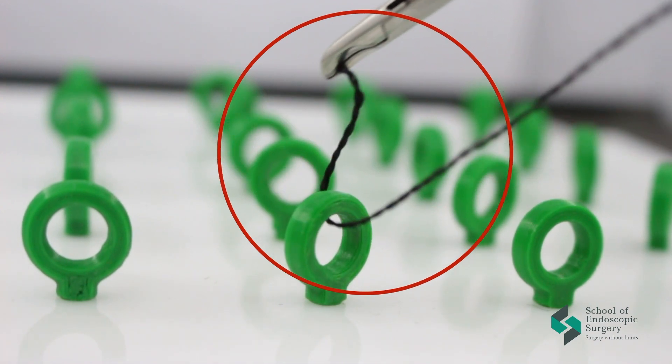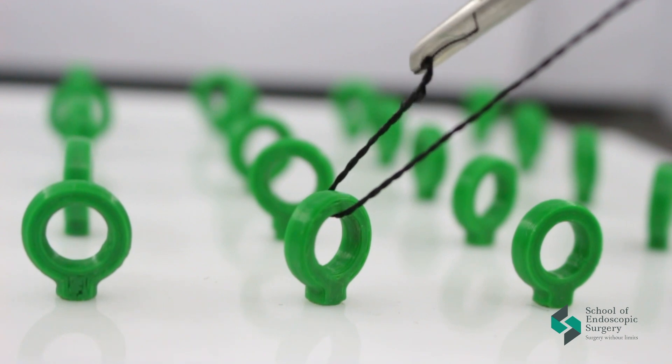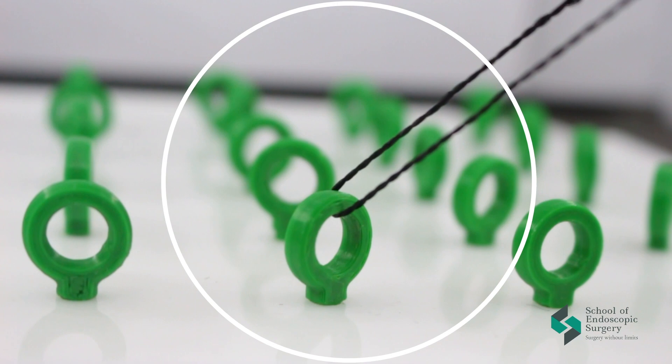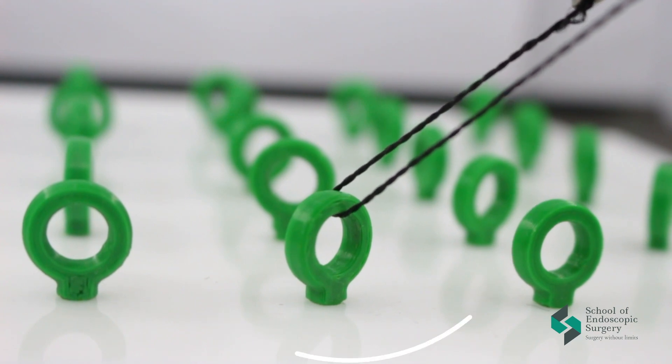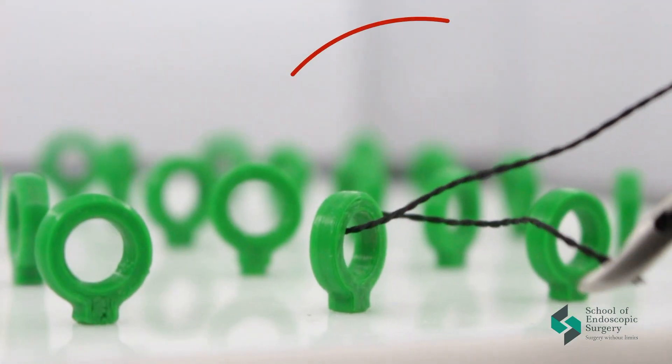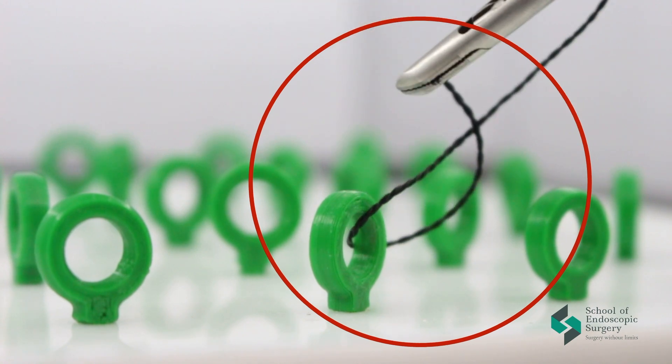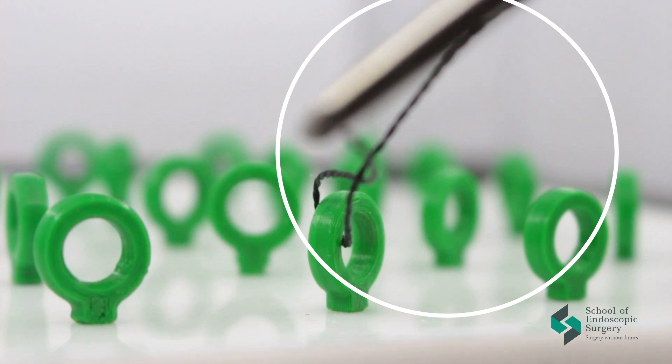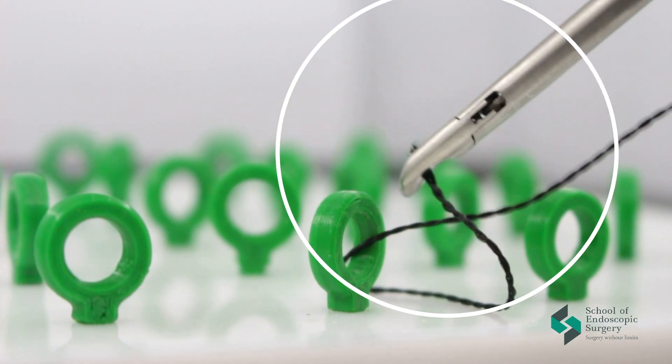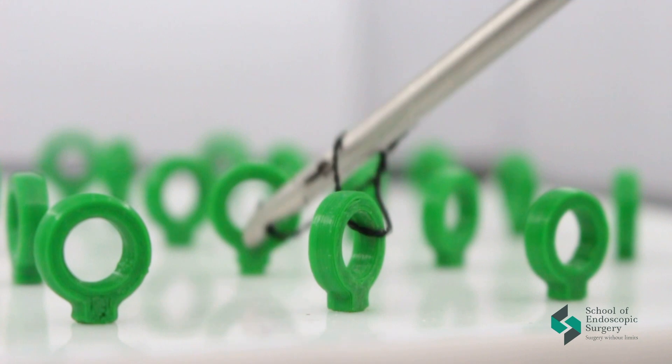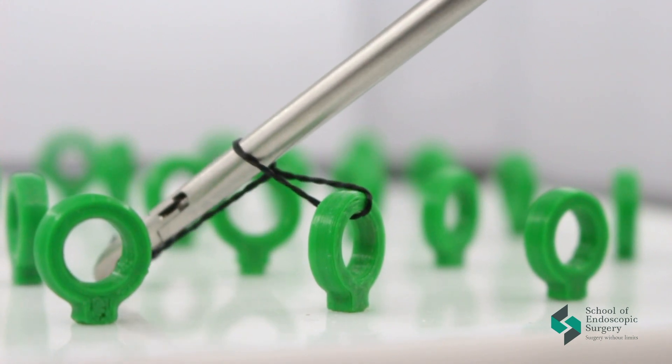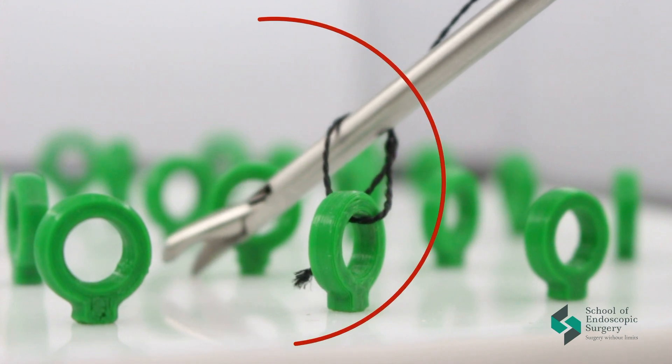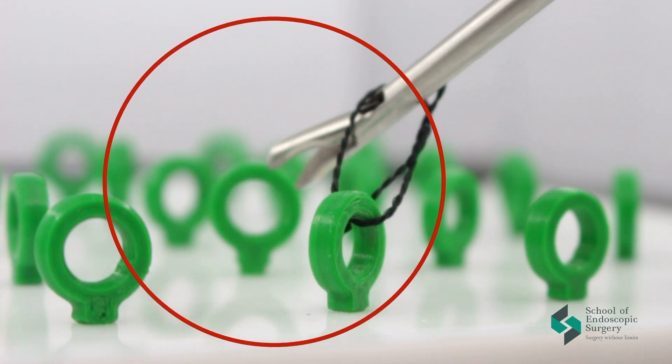The second mistake is the weakened end of the thread. After we have gripped the thread, we go around the long thread by forming the loop and pull out the needle holder. Don't forget to close the instrument when you pull it out.